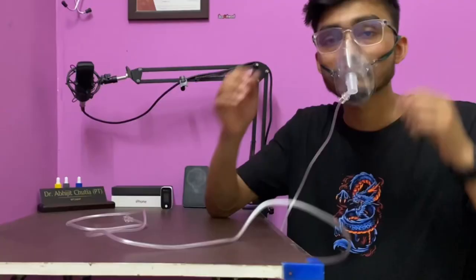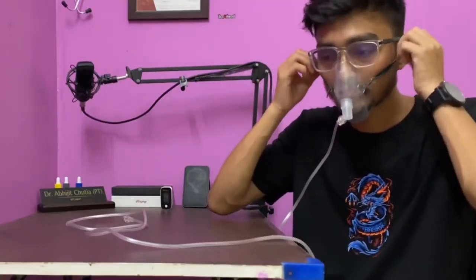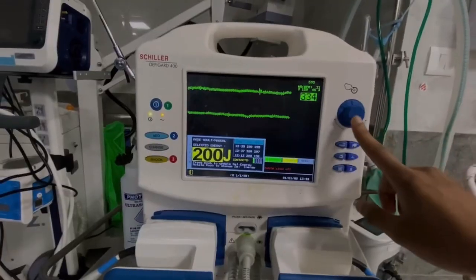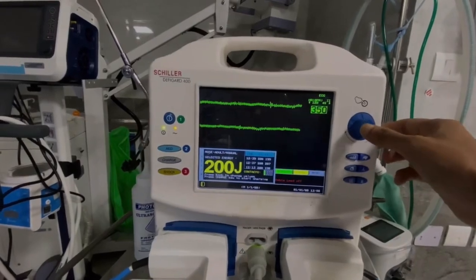These arrhythmias can cause the heart to stop pumping blood effectively, leading to a lack of oxygen supply to vital organs, which can result in death if not treated immediately. In this video, we will learn about the manual defibrillator procedure.